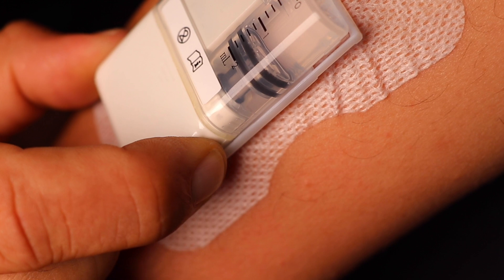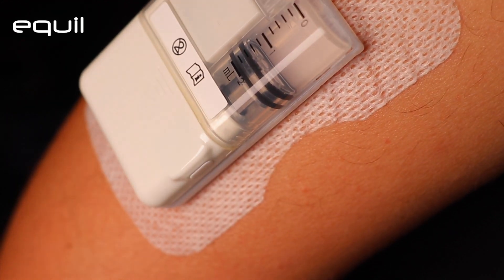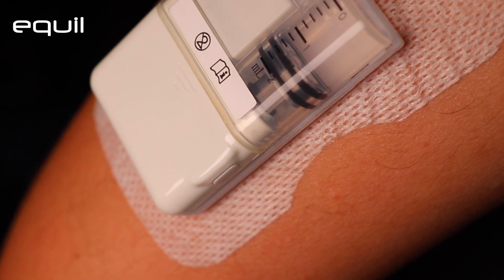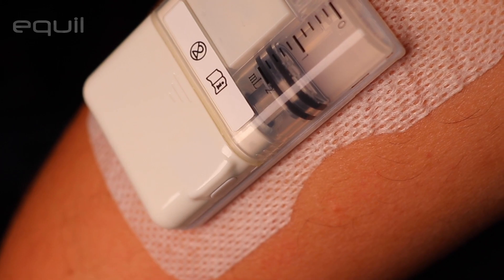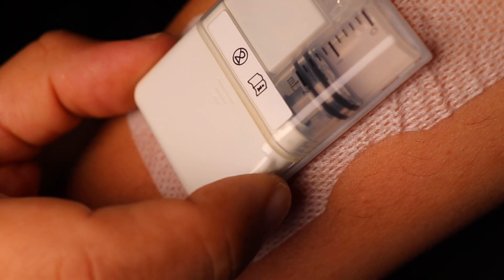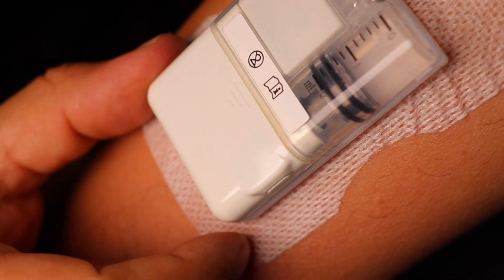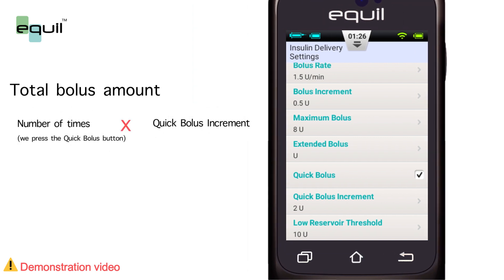Press and hold the bolus button on the patch pump. The pump will give an audible alert indicating that quick bolus was activated, and you can enter a quick bolus amount. With each subsequent button press, the bolus size will increase by a predetermined increment. The total bolus amount will be the number of times you press the quick bolus button multiplied by the quick bolus increment value.